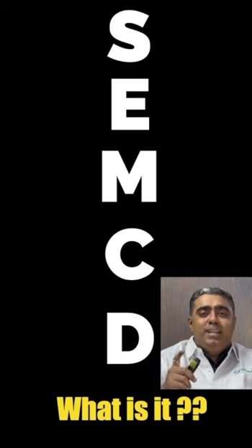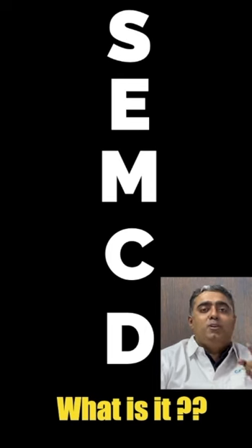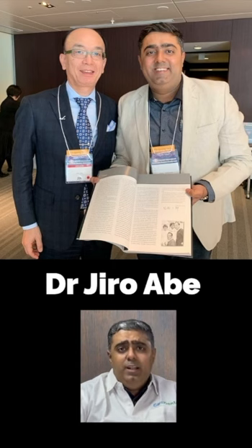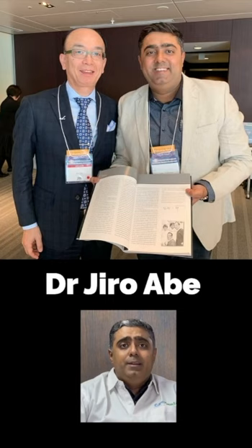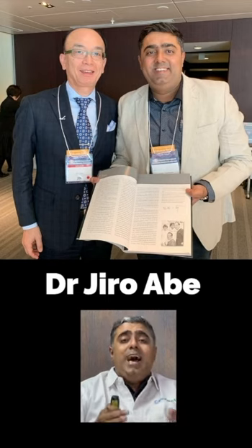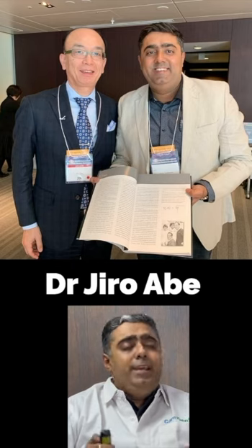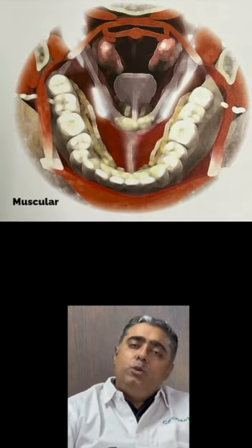My name is Dr. Amit Sadwani, and I'm your prosthodontist for today, for your good quality comfortable complete dentures. Suction effective mandibular complete dentures were first proposed by Dr. Jiro Abe from Japan. He listed a few factors which are essential in determining whether a particular patient is actually suited for the SEMCD technique or not.